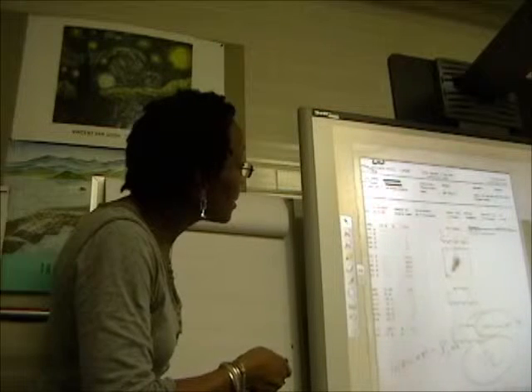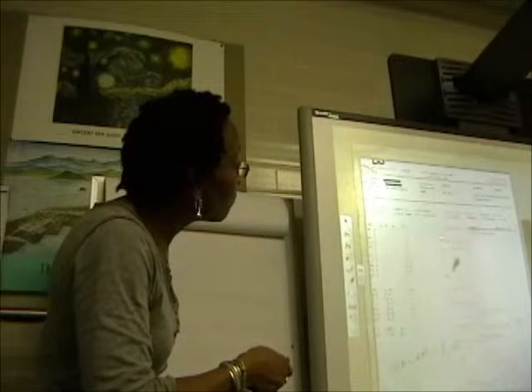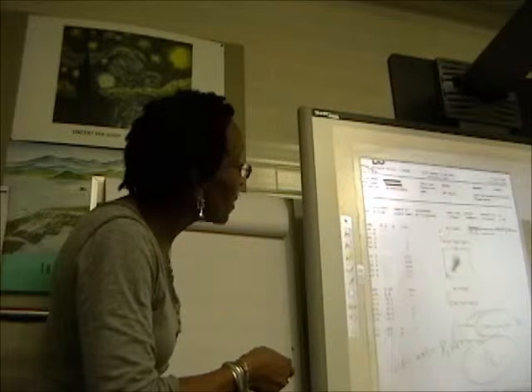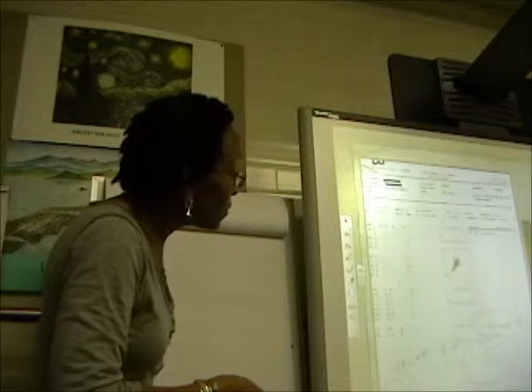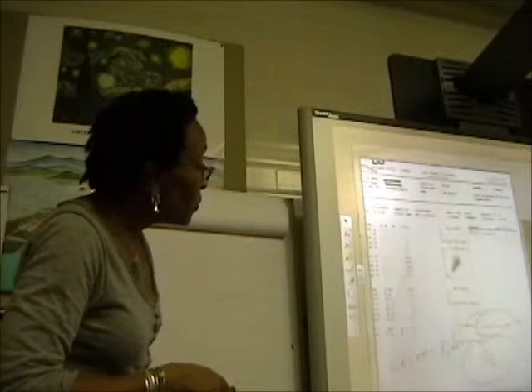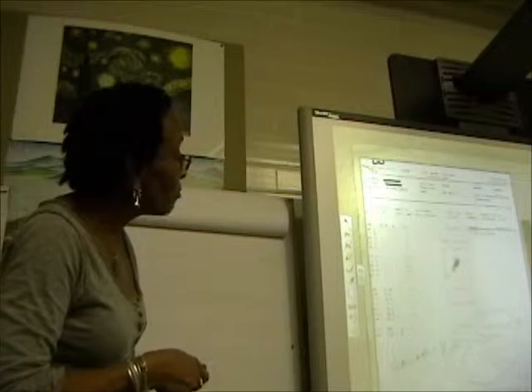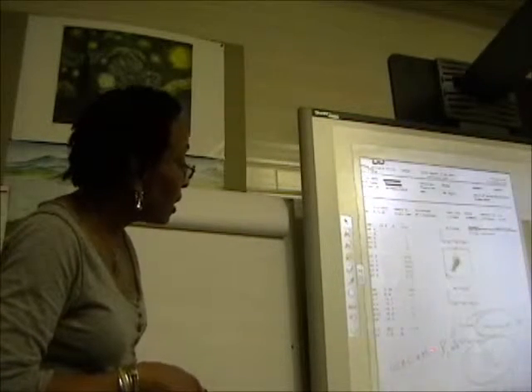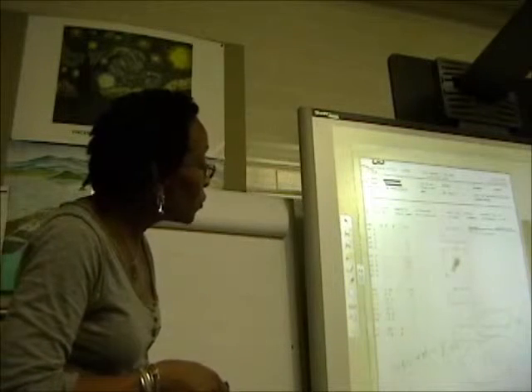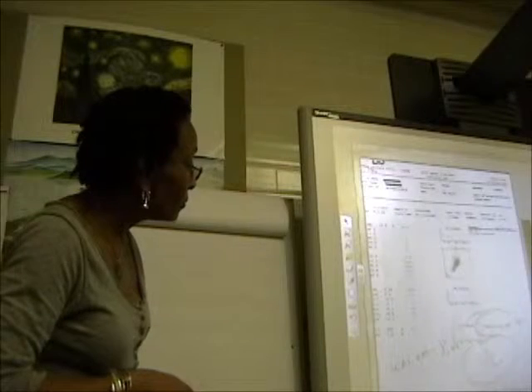But at that same 35 femtoliters, you can see that you've got some disturbance, and that could be the platelet clumps. So the person who did this ran this twice, and they had to do a diff on there because the diff was voted out. They checked for clots before they put out the results.